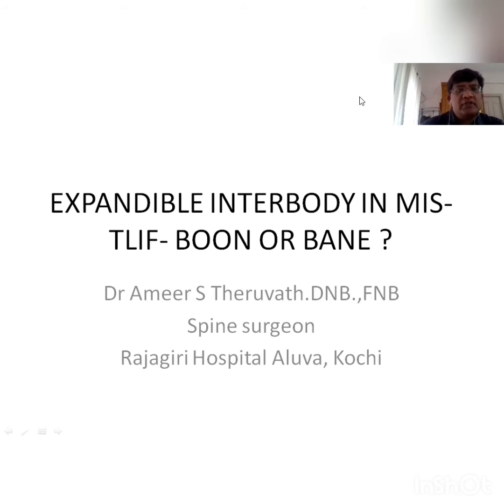I had two instances of suboptimal cage placement and a couple of cases of cage back out. Even though they were only radiological issues, I had to keep these patients under strict follow-up to make sure that they don't develop any instability or neurological deficits. That's the reason why I ventured into this expandable device, in the hope that I would be able to maneuver the cage to my position of choice, and also the distraction might help me get a firmer grip on the interbody to prevent the incidence of back out.